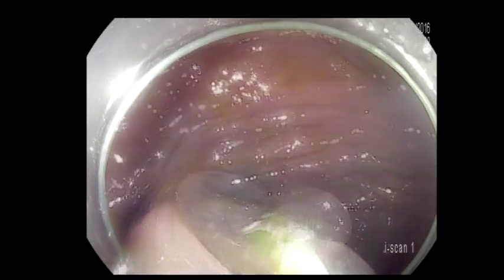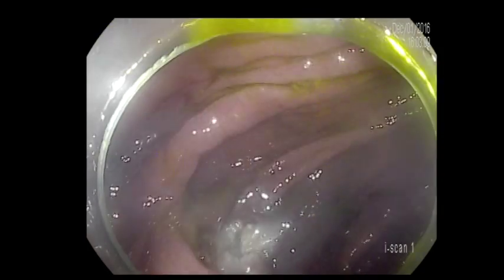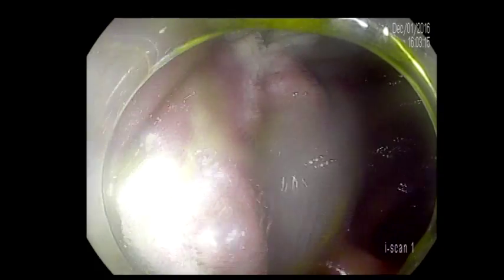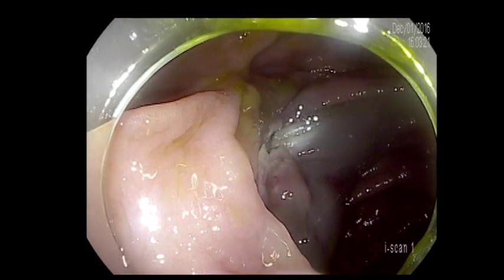The second mistake was that I kept cutting in spite of seeing that, hoping that I could remove as much as I can. So see what happened here: we got the proximal part with the upper part of the lesion, but the middle part is still there. This does not look like a good EMR so far.